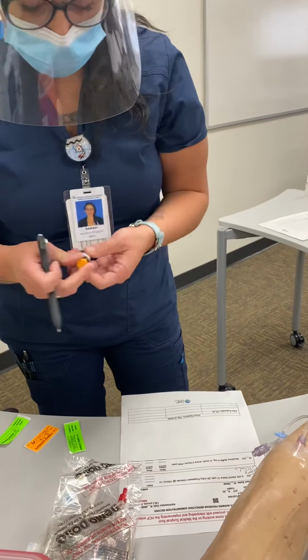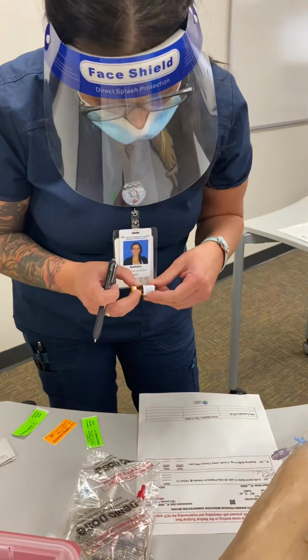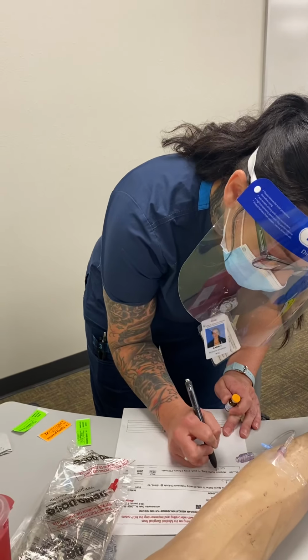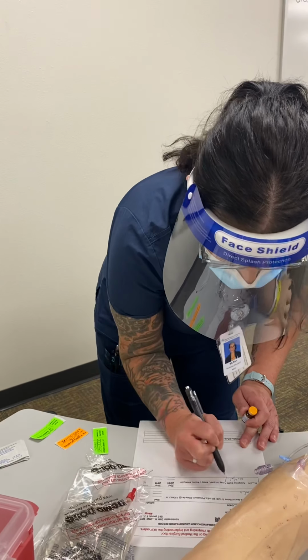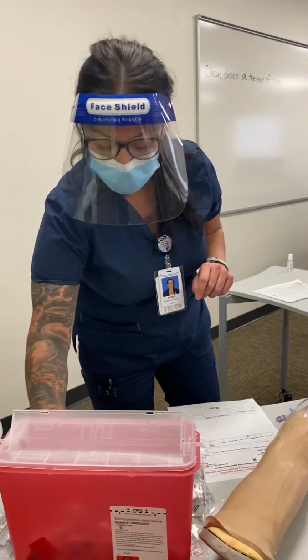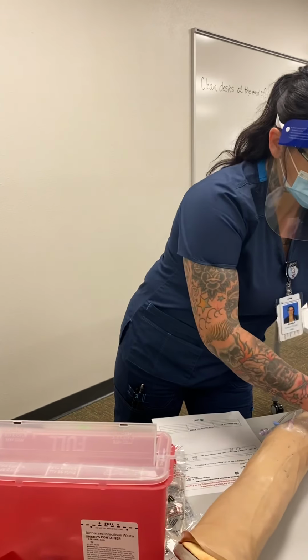All right, so next is the morphine. I got my morphine. It matches, and available is 10 milligrams per mil. So I know that I need to withdraw 0.4 milliliters, and I'm going to dilute that in 1 milliliter. I'm sorry, 1 milliliter of normal saline. So that's good to go. I can now prepare my medication. So I need to put on gloves.